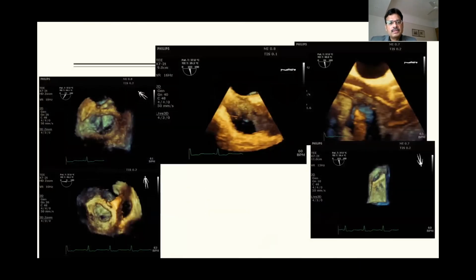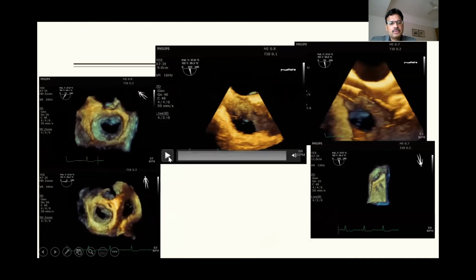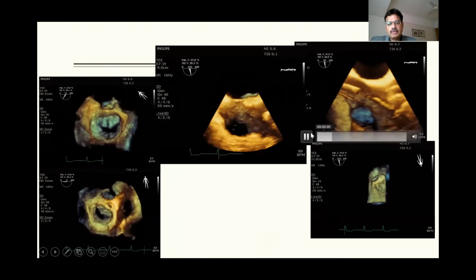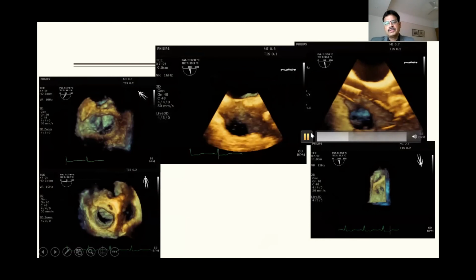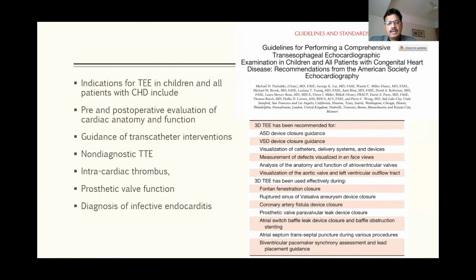Similarly, 3D gives you excellent views, and as cardiac anesthetists, we would probably be very interested in developing the surgical view or the enhanced view of the mitral valve, seeing the full volume loops, the gated full volume projections for detecting lesions in the IAS, and the relationship of the various positions of the valves.